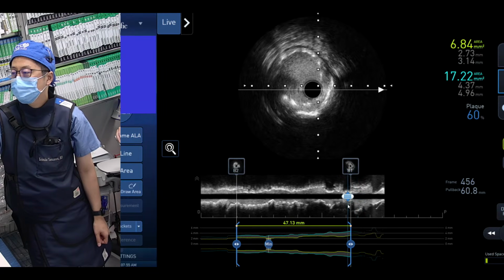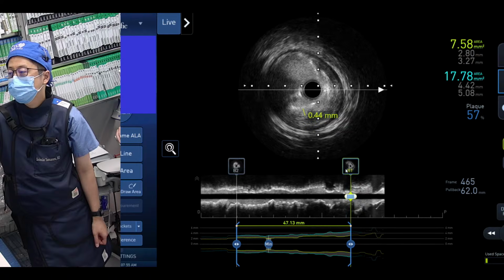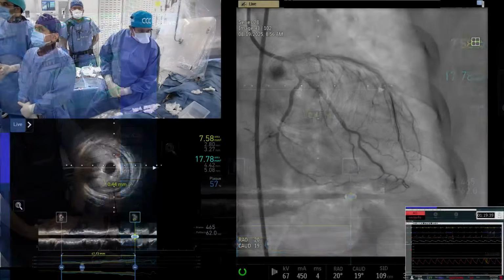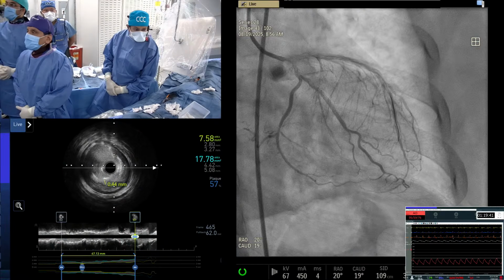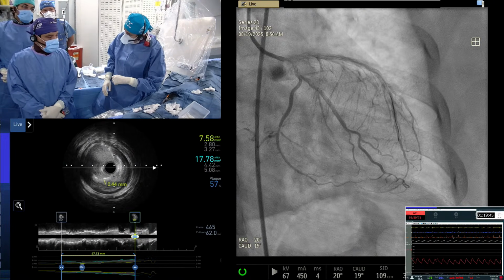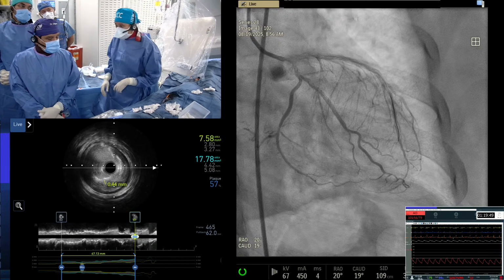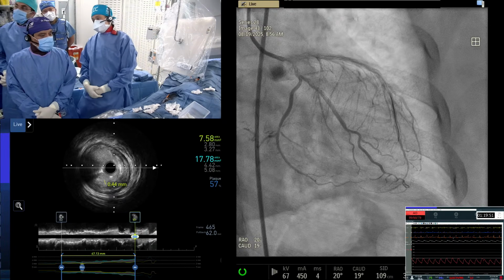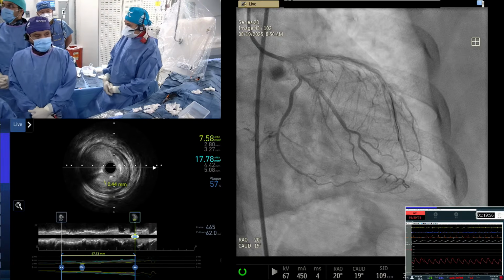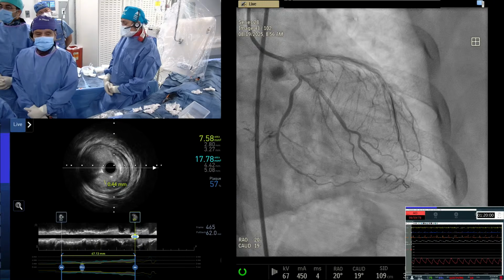A question about the antiplatelet strategy for this patient. Until now, the patient was on clopidogrel. I think it will be reasonable, for a young person with a mini-crush technique, that we change it. I know we have 3 stents. His PRU with Plavix is 157. So I think it's reasonable to give at least prasugrel for a short period, and you can de-escalate after 3 months. But this will be a good case.